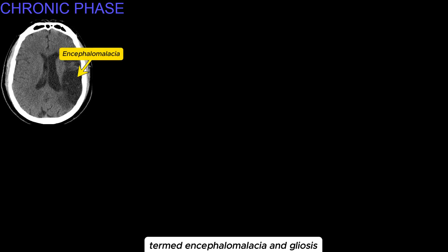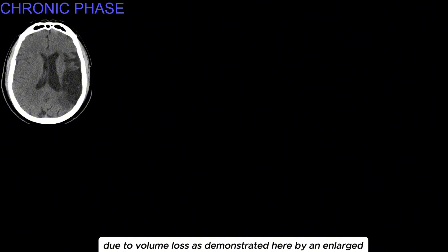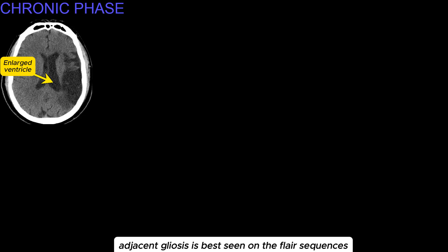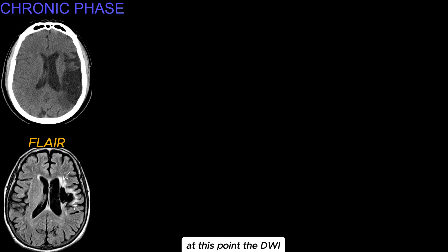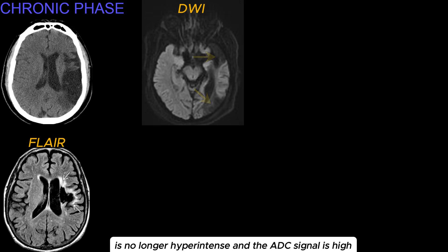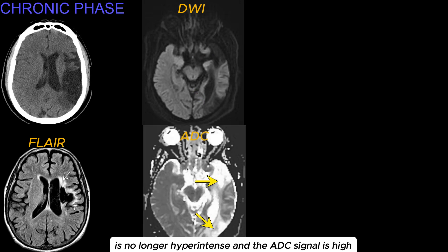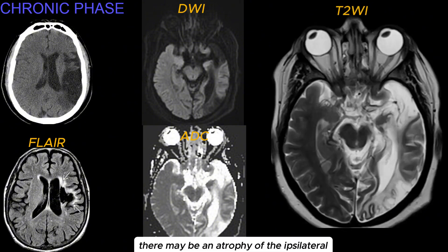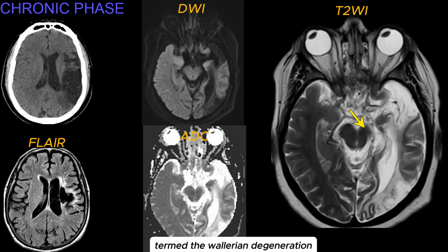In the chronic phase, the dead brain tissue has been removed by macrophages, leaving an empty space termed encephalomalacia and gliosis. Adjacent CSF spaces will become more prominent due to volume loss, as demonstrated here by a large left lateral ventricle. Adjacent gliosis is best seen on the FLAIR sequences. At this point, the DWI is no longer hyperintense and the ADC signal is high. If the infarct involved the corticospinal tract, there may be atrophy of the ipsilateral cerebral peduncle and pons, termed Wallerian degeneration.